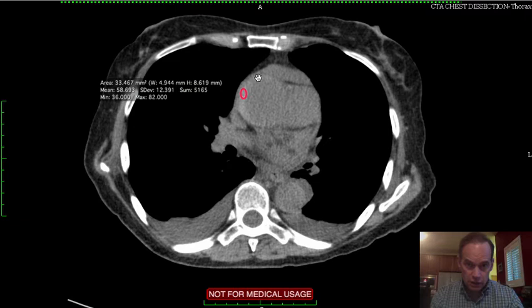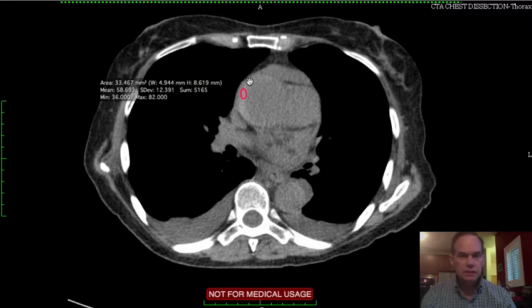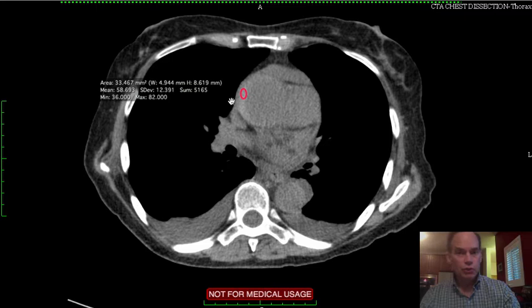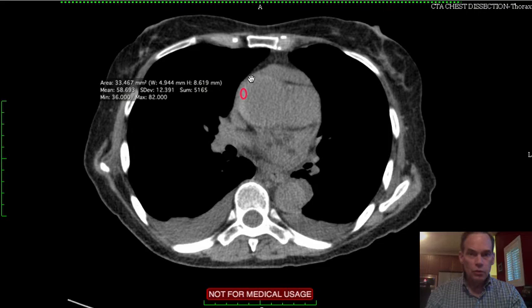It is hemorrhage that has occupied not the sub-intimal space, which would make it an intimal dissection — which is much more common than this. This is an aortic mural hematoma. The wall of the aorta, the media of the aorta — the layers being the intima, media, and adventitia, adventitia being the most peripheral — this media has hemorrhage in it now. It is therefore not only more dense, but it is thicker. So we have a mural hematoma of the ascending aorta.